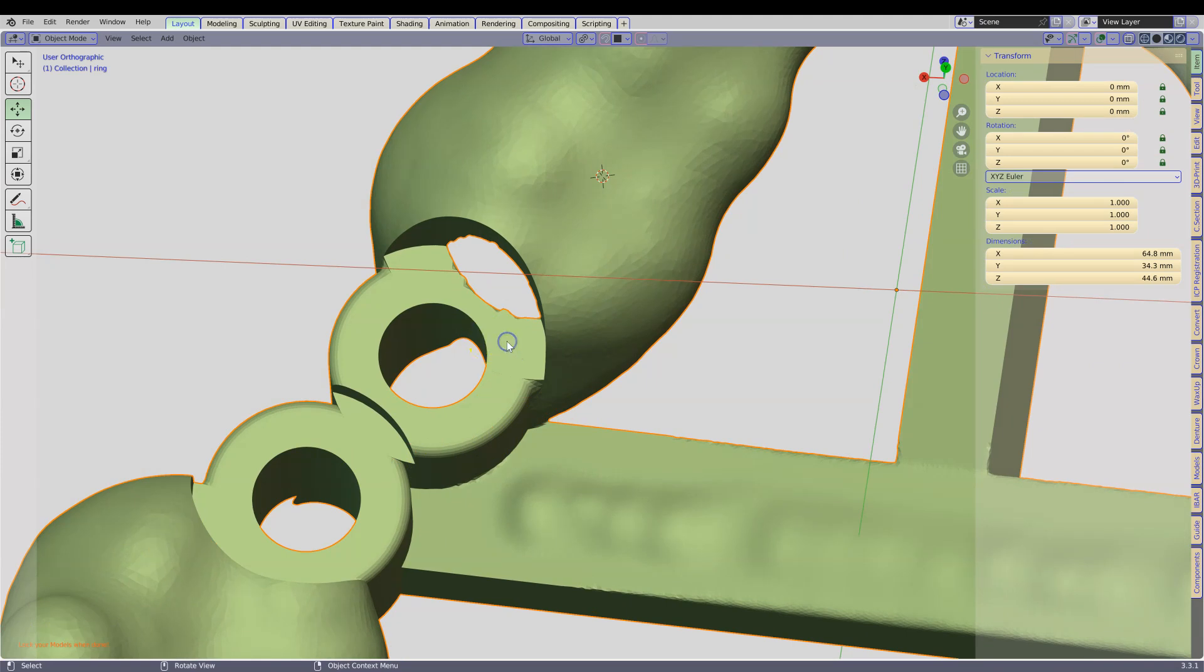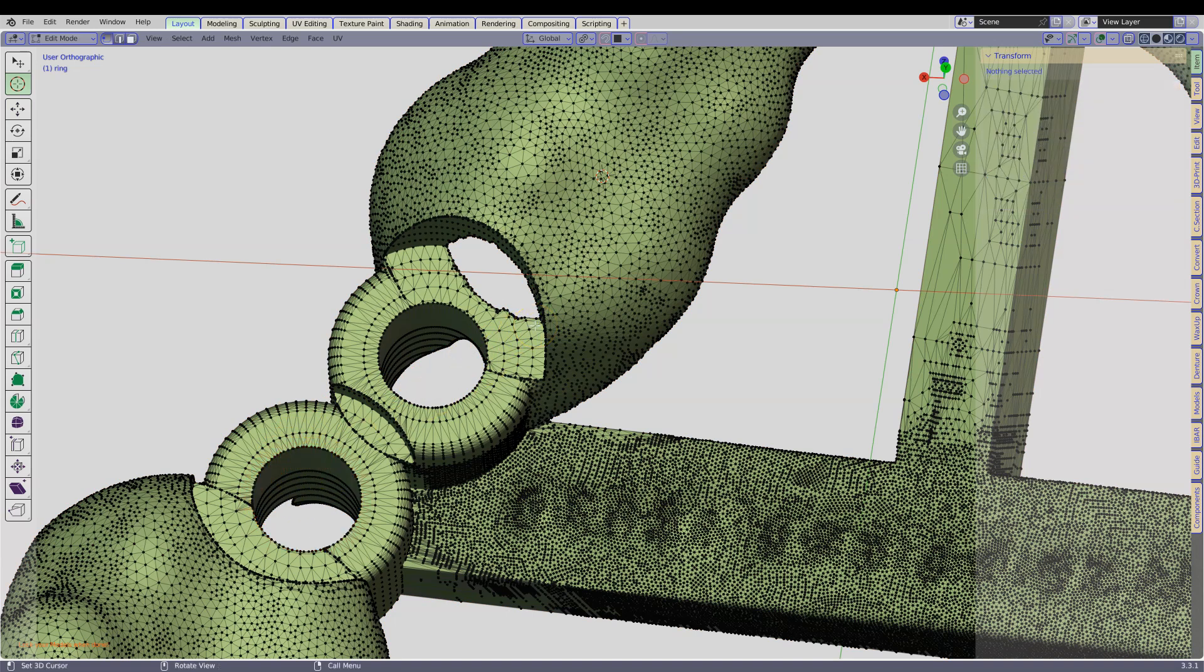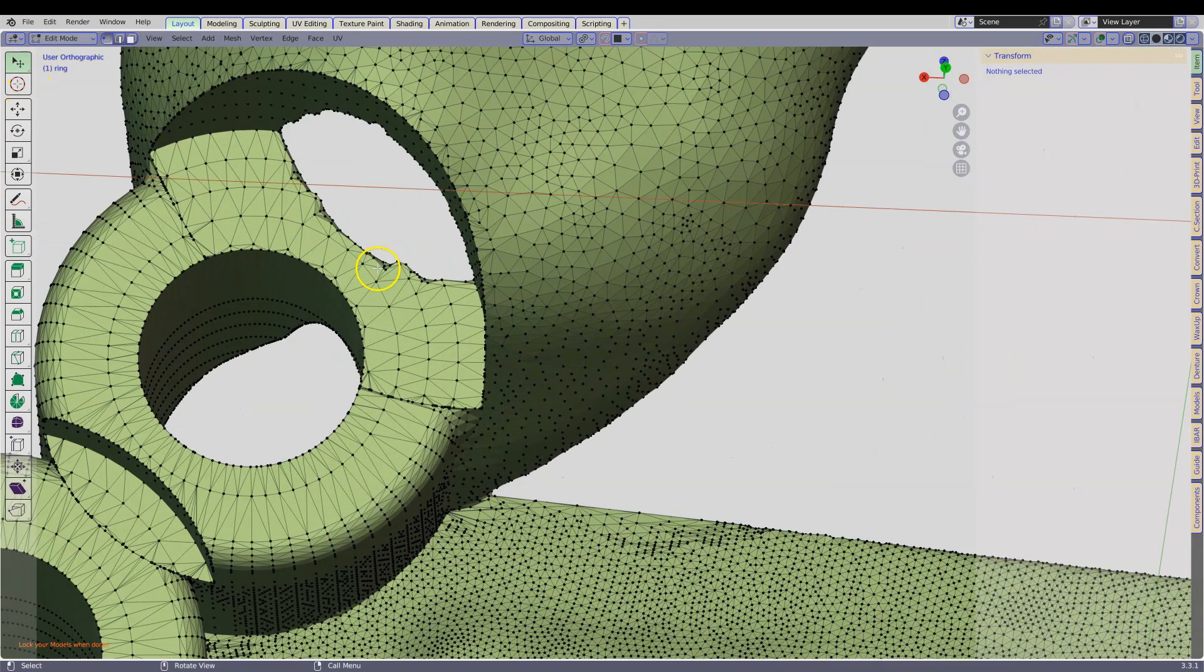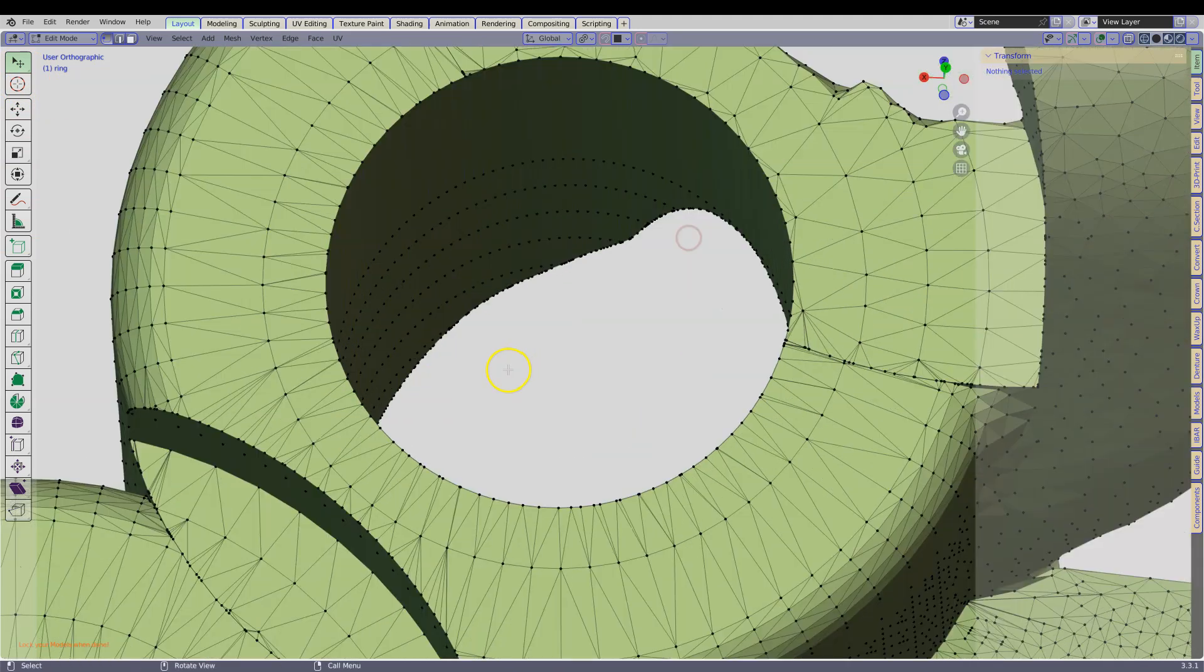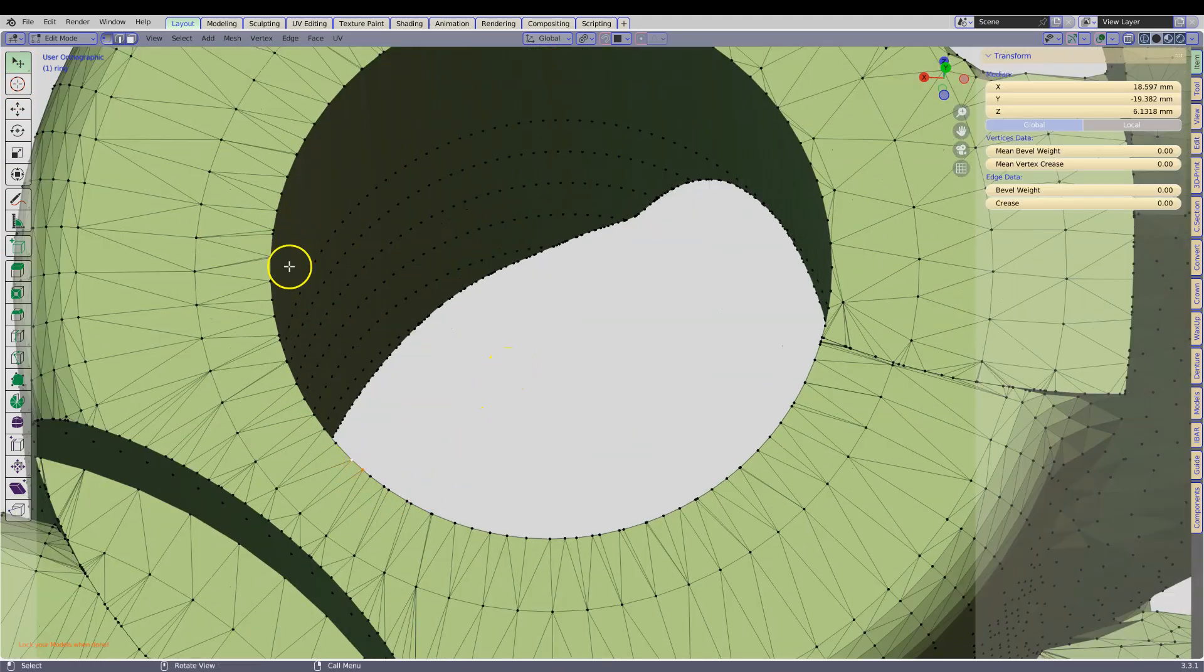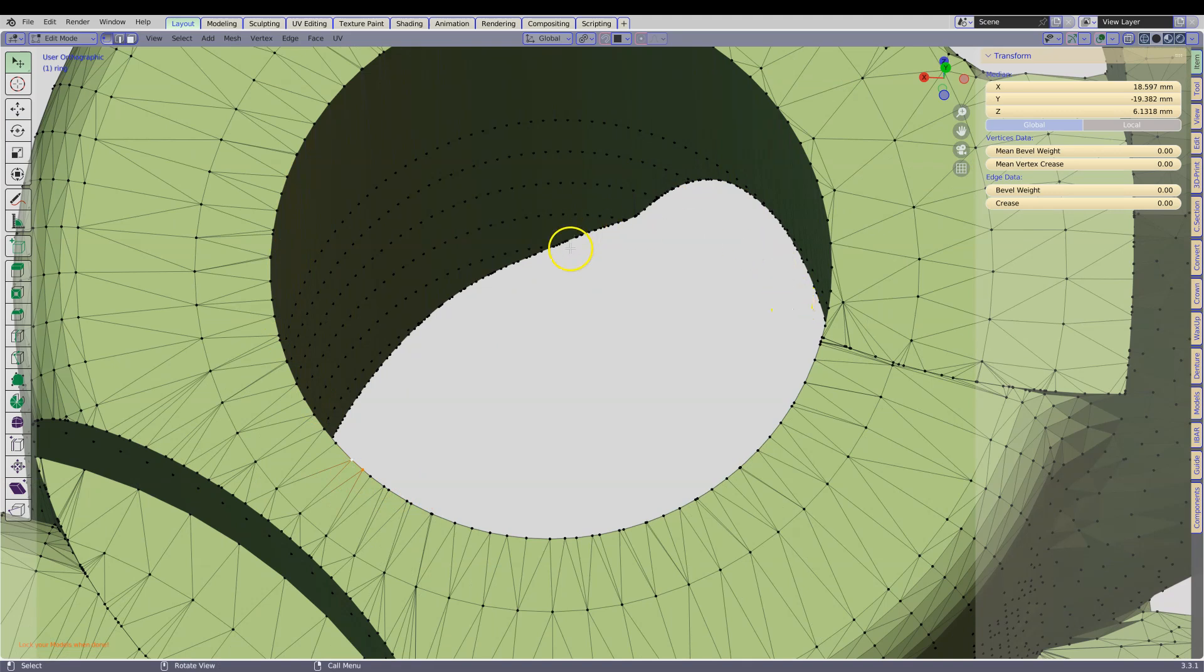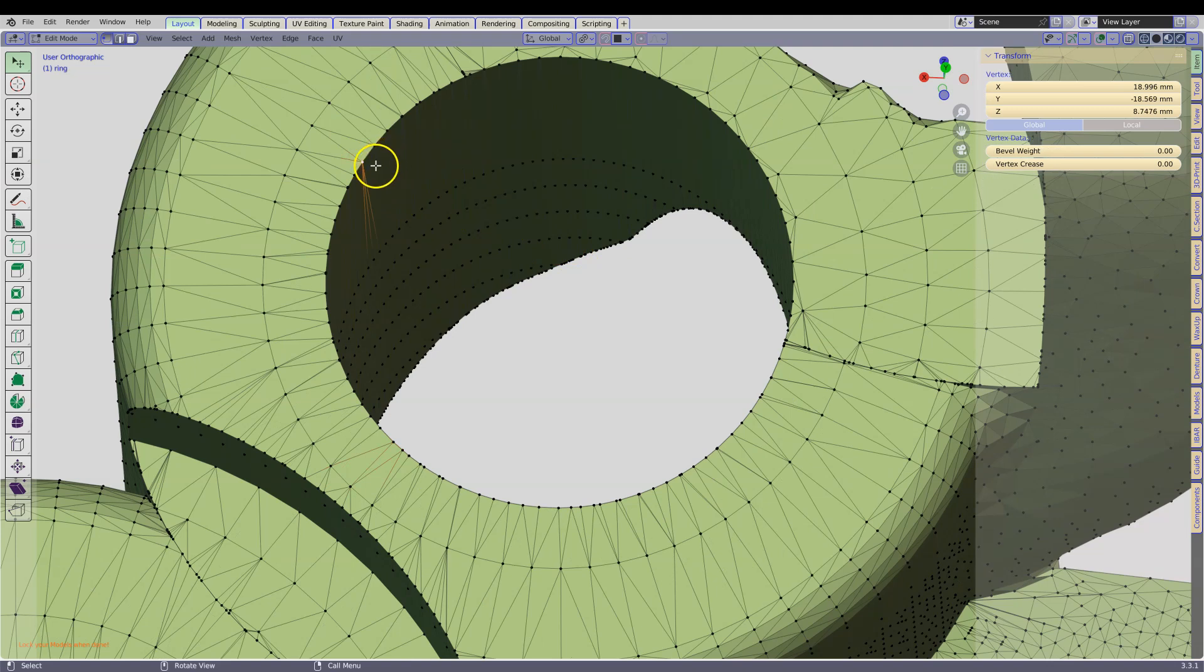Click on the Tab key, then Alt A to deselect all the vertices. Make sure this is set on cursor, so select this one. Then because we cannot Alt left click to select the edge loop going around it, the geometry is too complicated. We are going to select a few vertices along the perimeter of the circle.